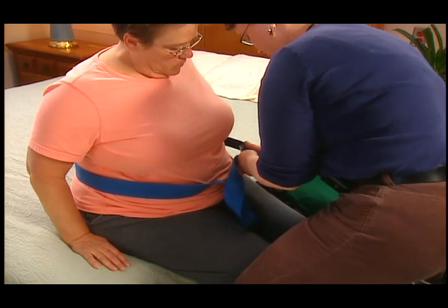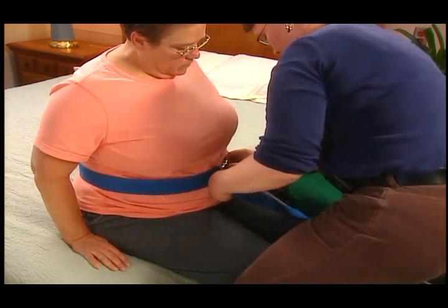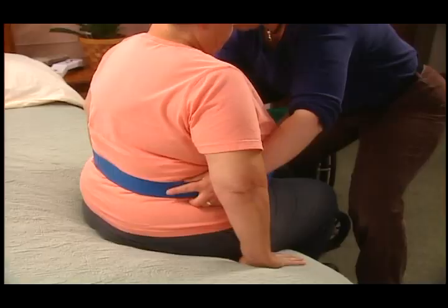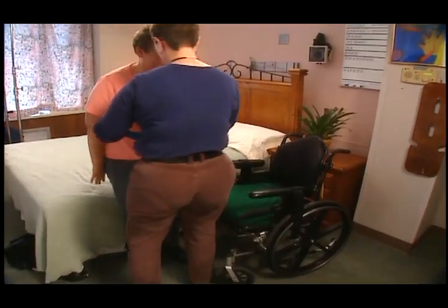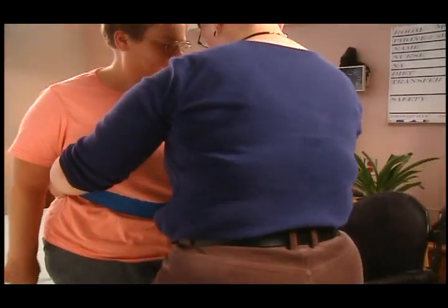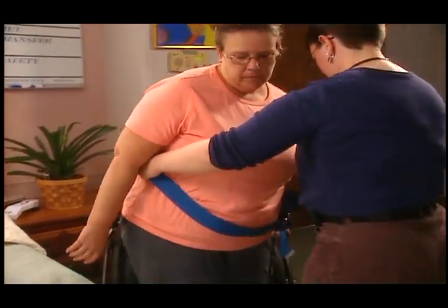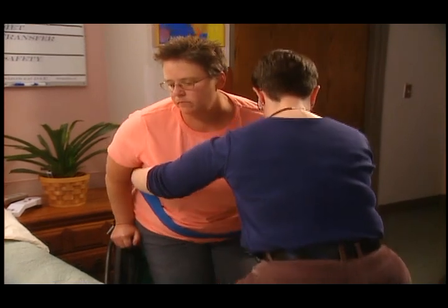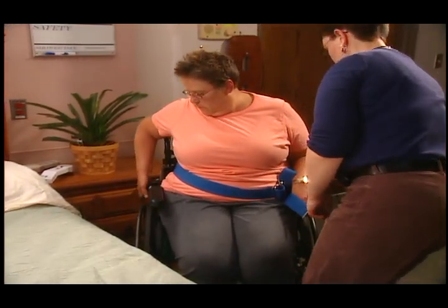Notice that the first thing the therapist does is to apply a transfer belt securely around the patient's waist. The therapist bends her knees, keeps her back straight, and grabs the transfer belt. She then helps the patient to lean forward and, using some momentum, assists her to a standing position. Once the patient is standing, the therapist helps the patient to swivel toward the transfer surface and guides her hips down as she is being seated.